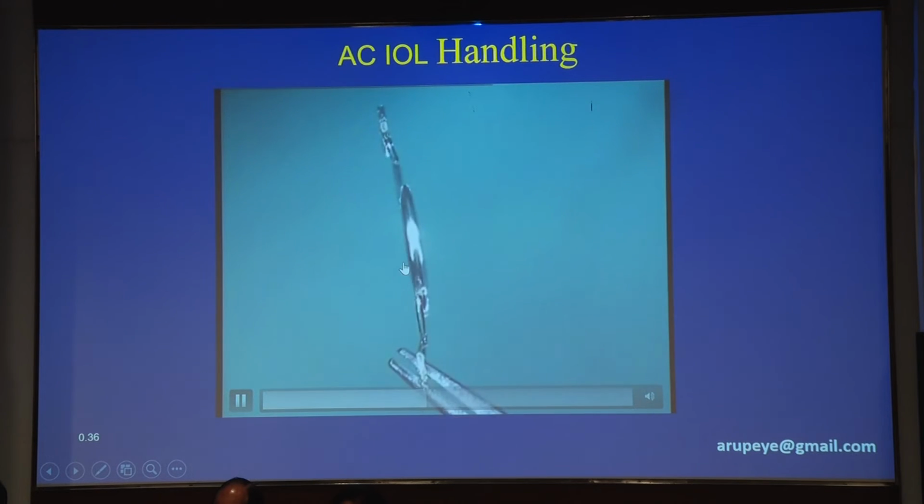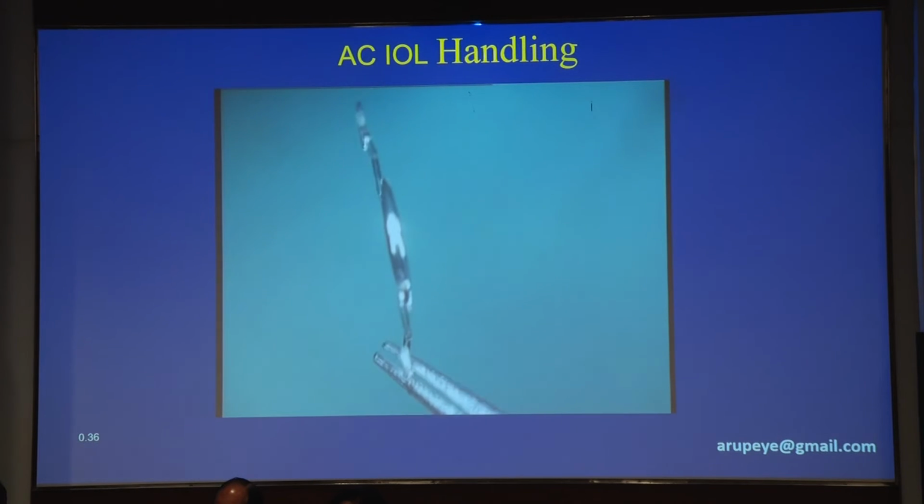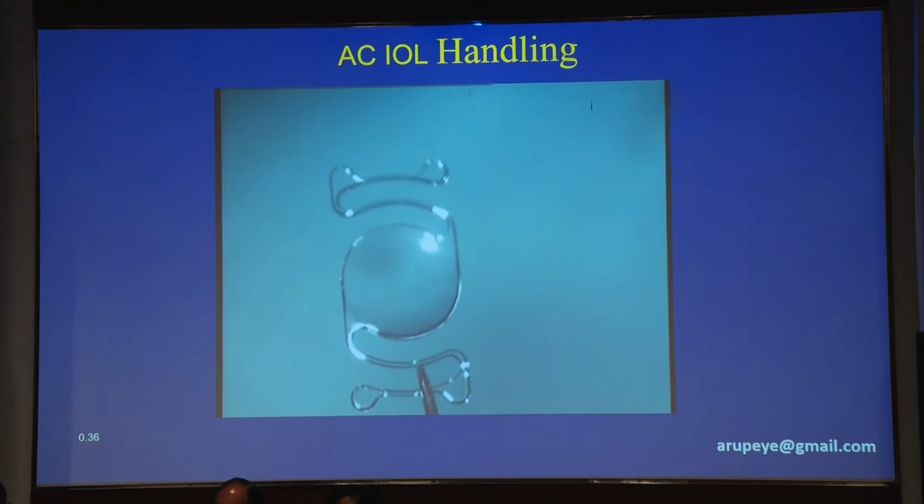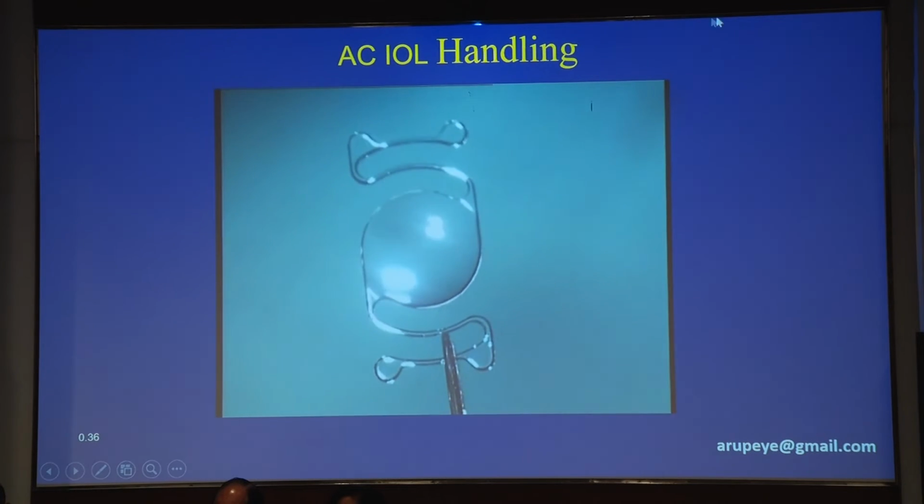The lens has to be vaulted anteriorly when it goes into the eye. In many situations I have seen in live surgery, experienced surgeons have flipped the lens, so the lens is vaulted posteriorly, scraping the iris tissue, and then postoperatively you can expect UGH syndrome in these patients.